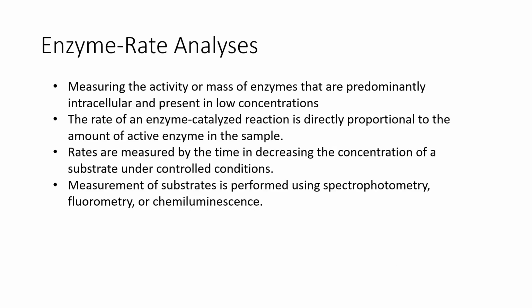There is one other technique that I just wanted to mention here, and that's enzyme rate analysis. Measuring the activity or mass of enzymes that are predominantly intracellular and present in low concentrations is important. The rate of an enzyme-catalyzed reaction is directly proportional to the amount of active enzyme in the sample. Rates are measured by the change over time in the concentration of a substrate under controlled conditions. Measurement of substrates is performed using spectrophotometry, fluorometry, or chemiluminescence.